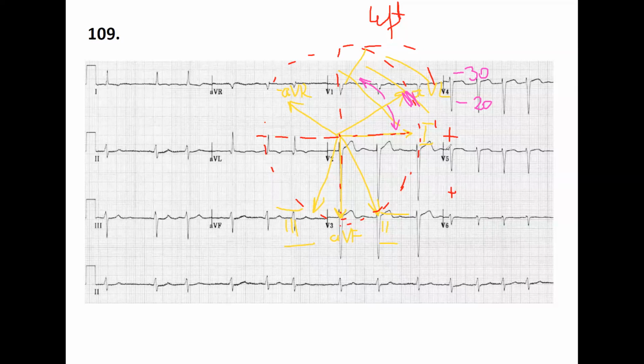If lead number 1 is negative, immediately you can say it is a right side, let's say pathological right deviation. Immediately you can say it. Doesn't matter too much. Okay. Let's go on.